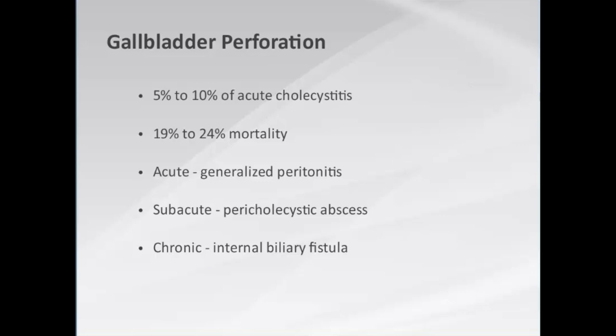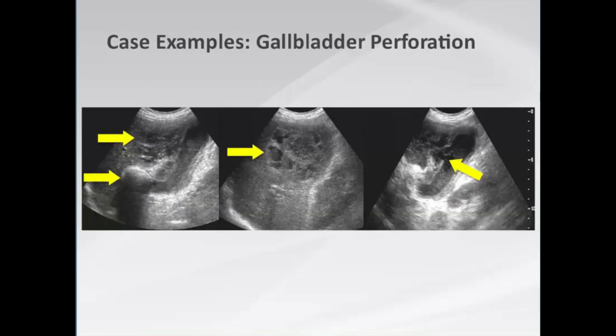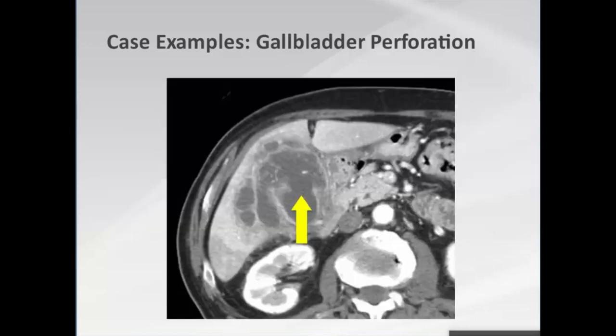In a case of a patient with pain for just over a week, there is a large gallstone in the region of the gallbladder neck and an additional process in segment five of the liver — the patient was septic, with features of a liver abscess. Looking more carefully at the gallbladder, we can see the point of perforation in grayscale. Note this gallbladder is not distended because it has perforated and decompressed itself — so the distensibility rule doesn't apply once perforation has occurred.